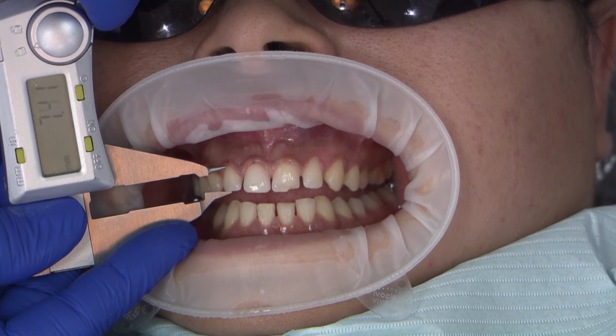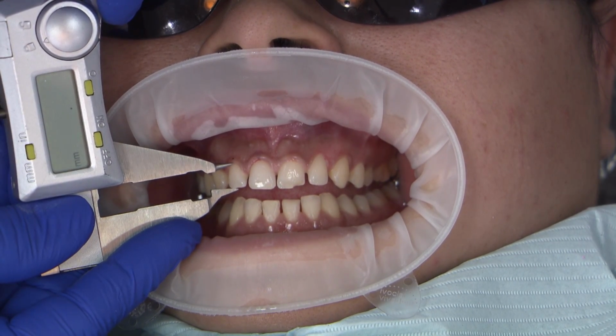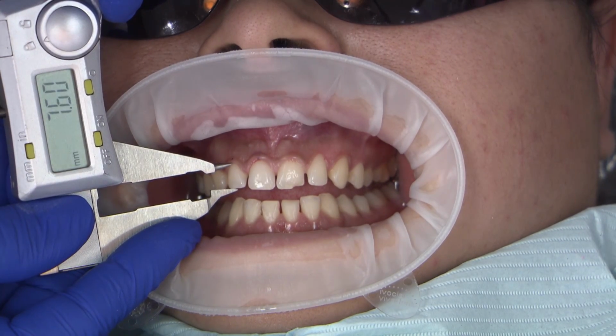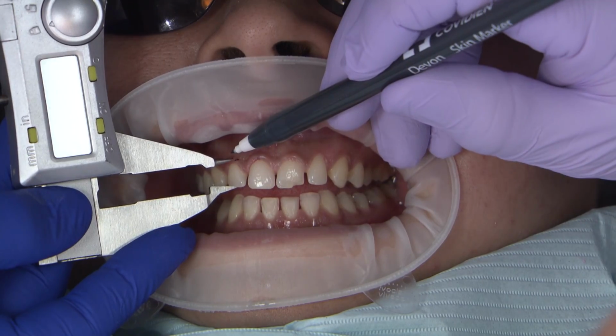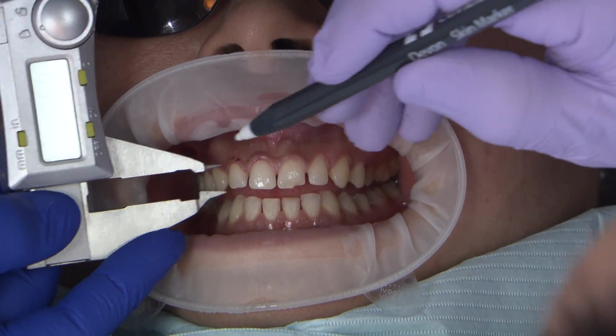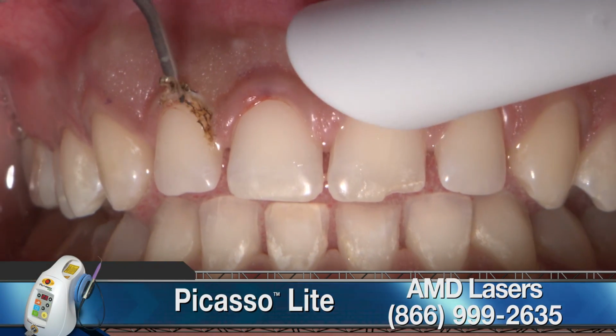The next step in correcting the gingival asymmetry, we look at the existing tooth height and compare it with the proposed height on the diagnostic model. On average, the length of a lateral is about 9 mm and a central is about 10.5 mm. We can use the snap-on template or mark the zenith and remove the gingival excess with a diode laser.